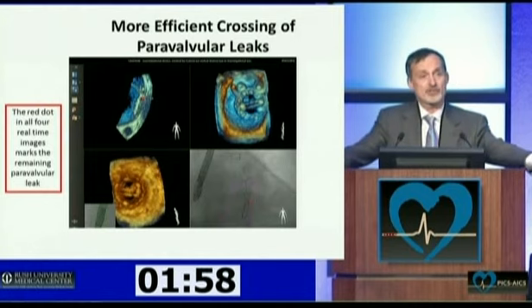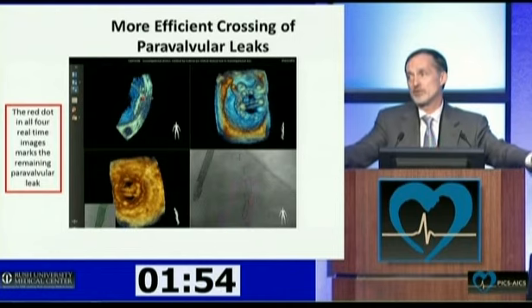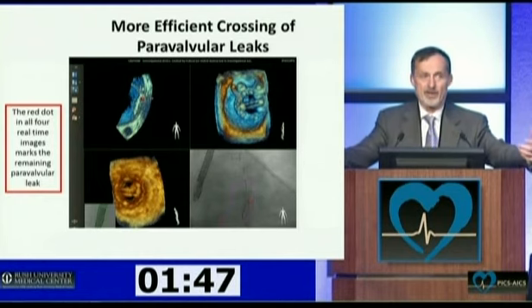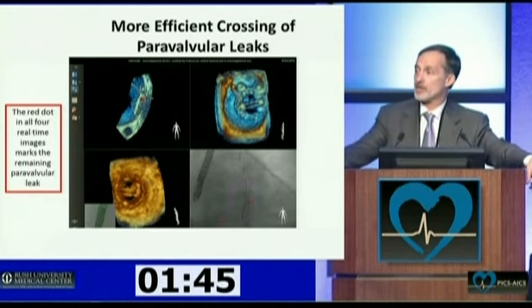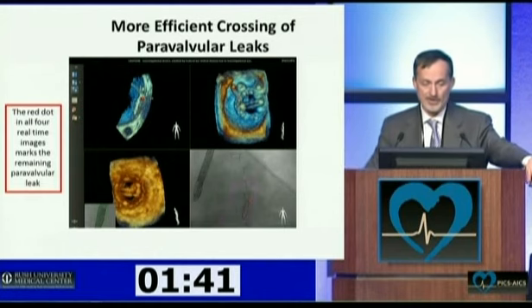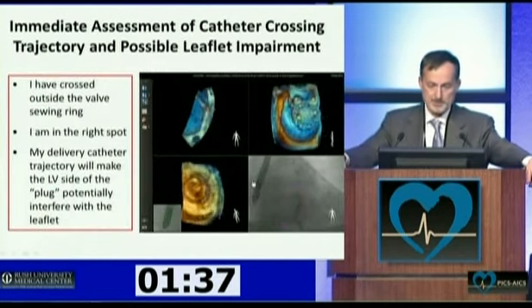So, more efficiency. I mean, we want not just good images, but we want to be able to do specific tasks that used to take a lot of time quicker. And that means, yes, if you're using fluoroscopy at all, less radiation, but it obviously has a lot of other advantages for performing maneuvers.